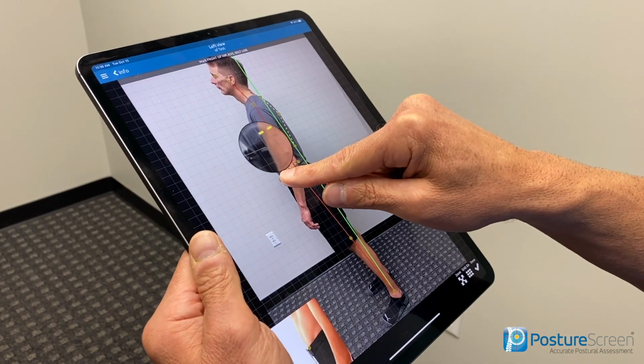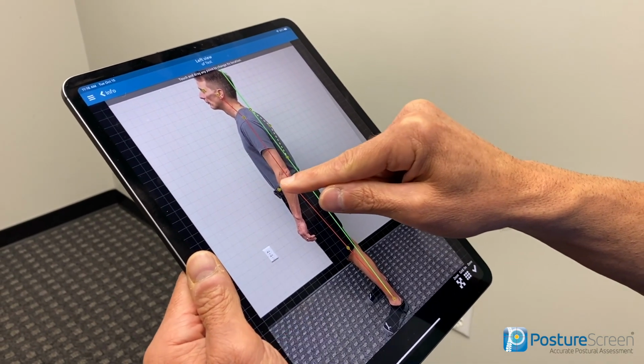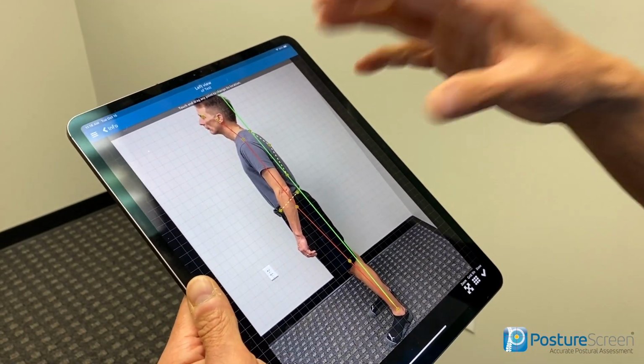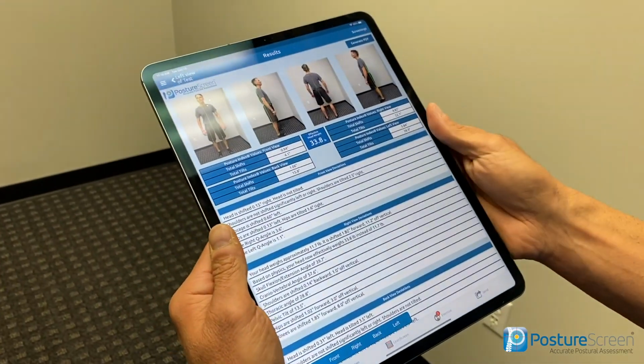And again, in this case, since he's fully dressed, the approximation of PSIS to ASIS is a little bit higher, so I'm going to bring that down. Everything else looks fairly good. So now I'm done with my four-view evaluation.